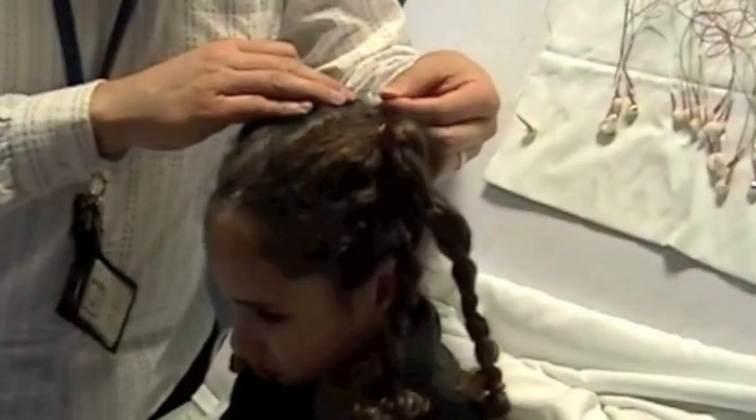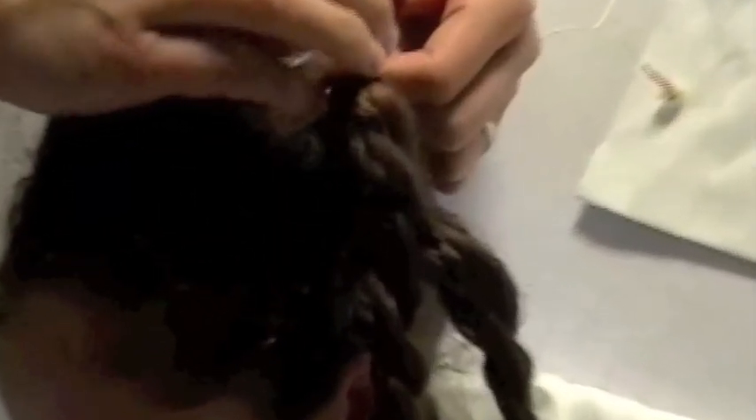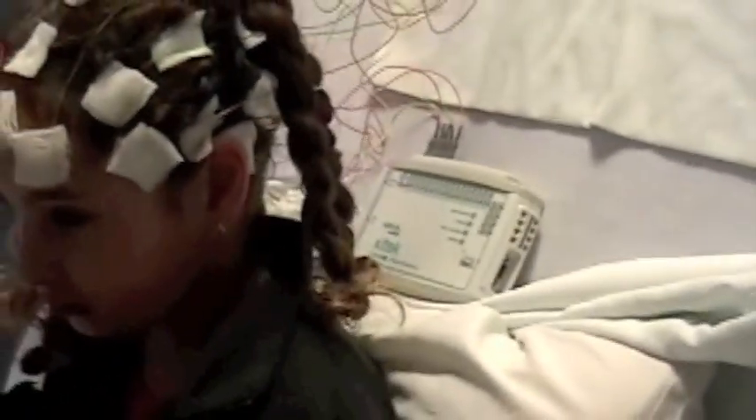Next, it is time to put the electrodes on Erin's head. You might feel the technician gently press on your head until the electrode stays. A soft bandage was also placed on top of the electrode to help it stay in place. At the end, Erin felt like she was wearing a hat. All of the wires will be connected to this special box — ask your technician if you want more information about what it does.